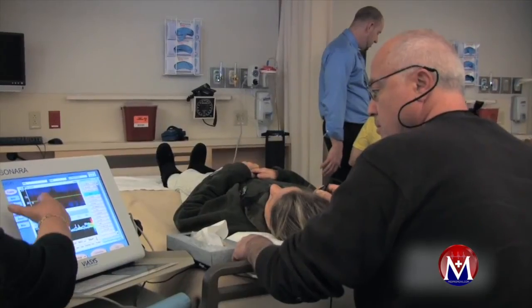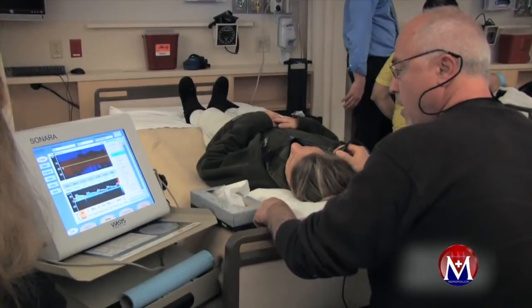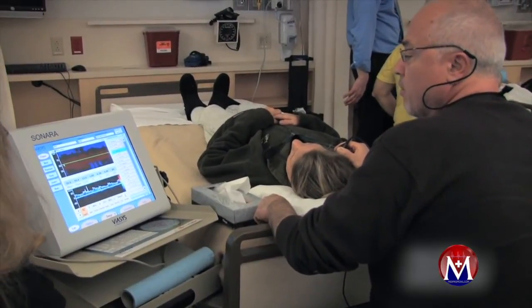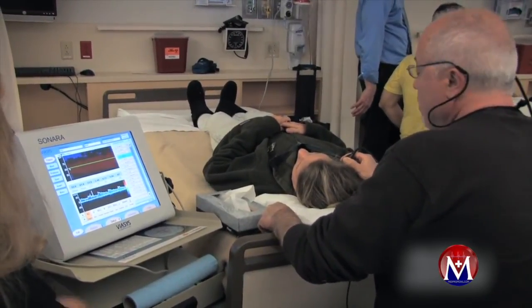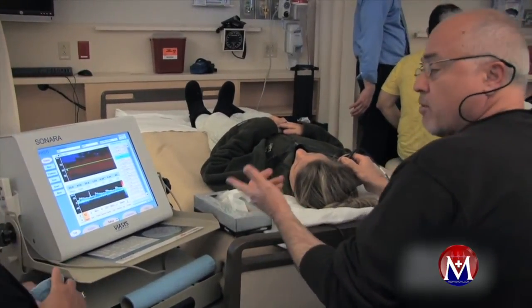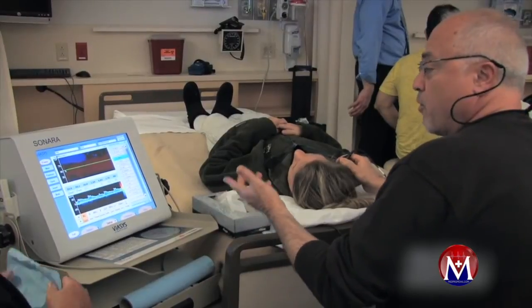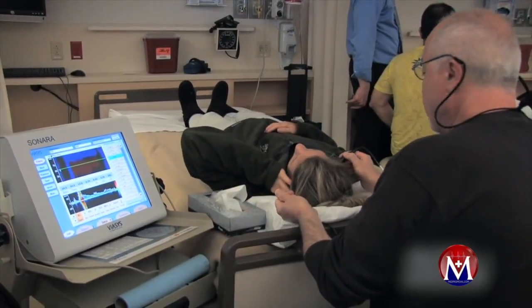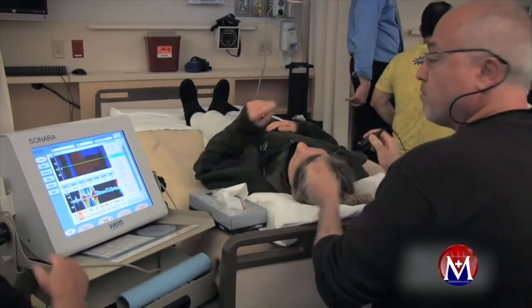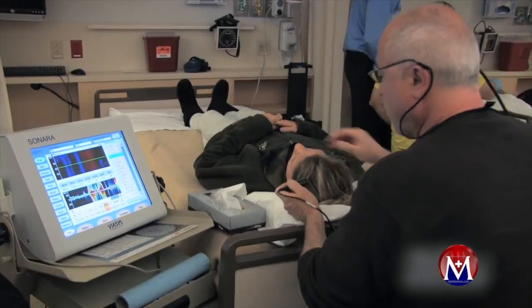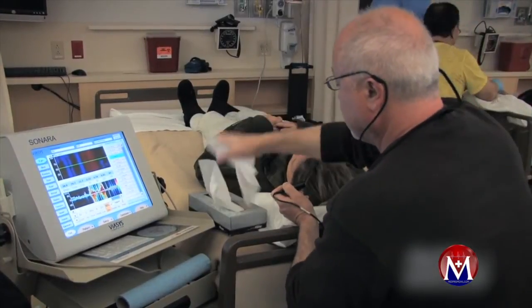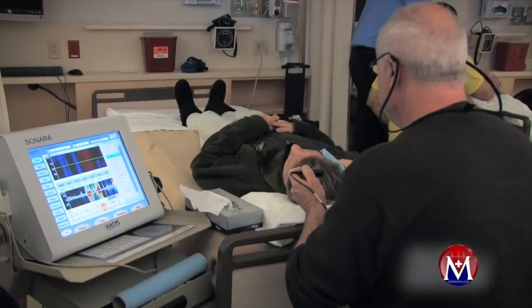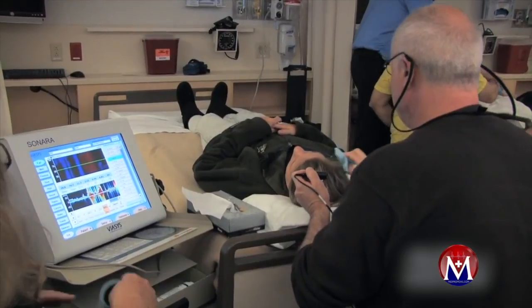Hear how low it sounds? That's excellent. For the other side, use your left hand — I won't let you scan reaching around. I'm a tough teacher.